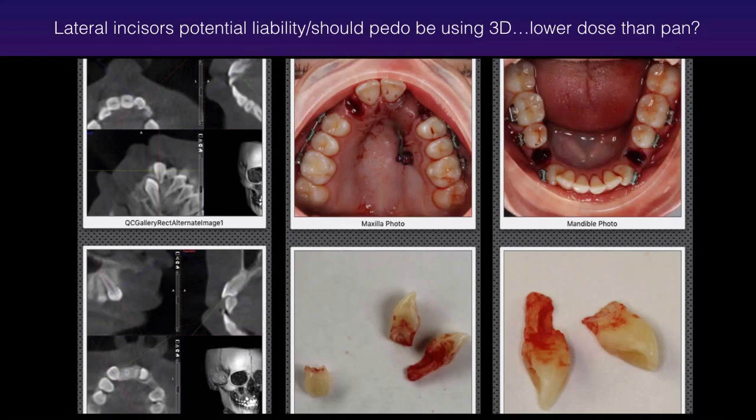And you can see there on the screen just how bad the resorption was. Now, hopefully we would have said, oh, well, if I was practicing in a 2D world, I would have obviously gotten periapicals on these. And I would have realized that it was damaged, and I might have treatment planned the case the same way.